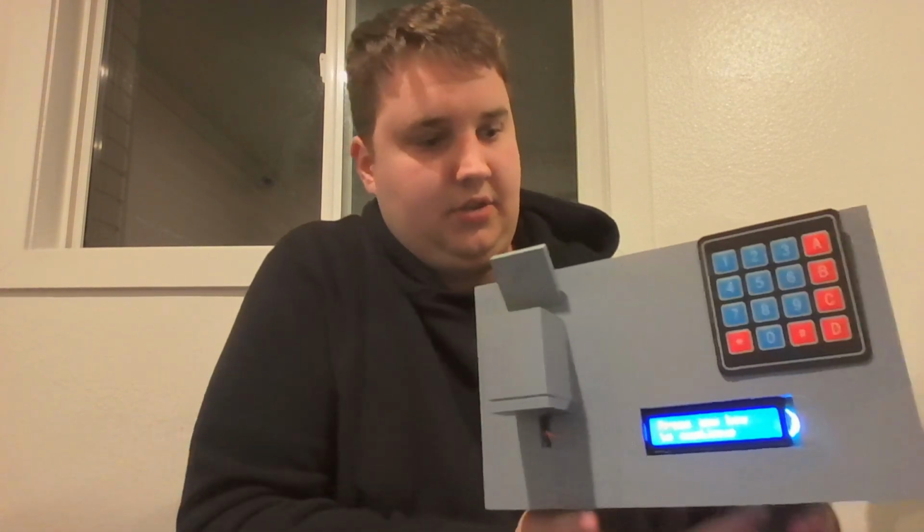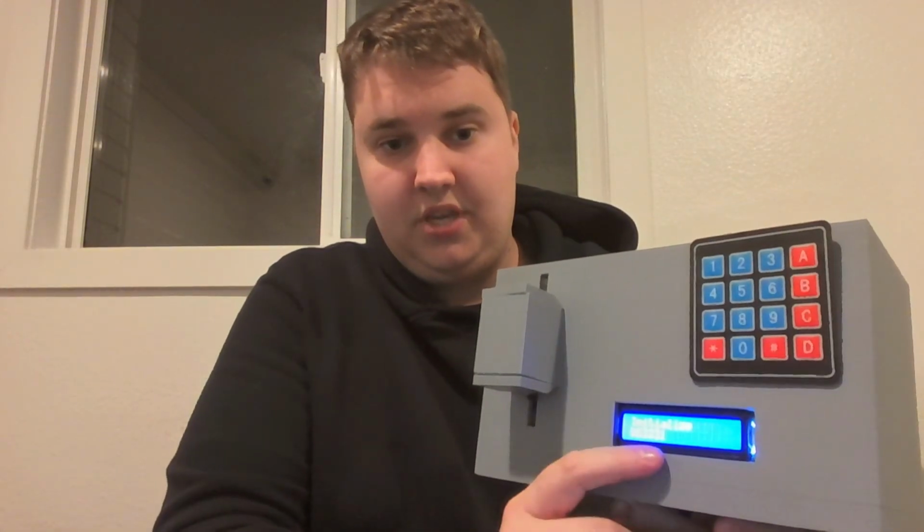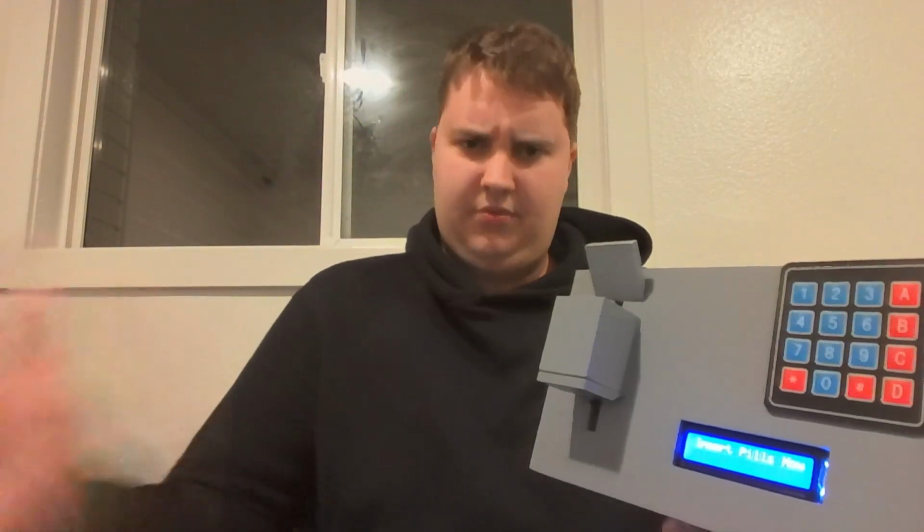Now I'm going to demonstrate the feedback loop of this project by walking you through exactly how a user would use it. So we're going to click the reset button. Once that is reset, a message should show up here that says initializing DS3231, which is the real-time clock, telling us that it's started its work. Now it's telling me that I can insert pills at this time. So I'm going to insert this dongle. Once that is inserted, it's telling me that I can press any key to continue.